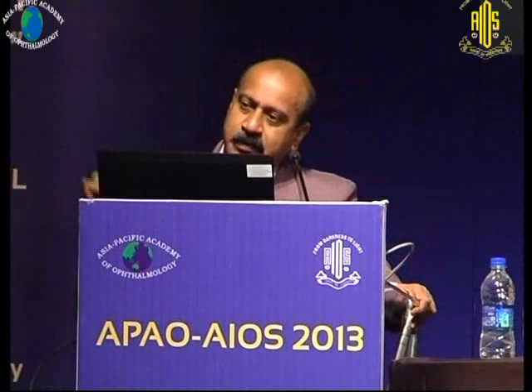Combined procedures like pars plana vitrectomy as well as scleral buckle have a set of indications: advanced stages of PVR, giant retinal tear, choroidal coloboma, traumatic cases. These are to be dealt with by always giving support for the tractional element so that it will have long-standing good results.